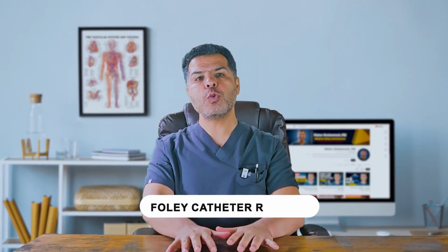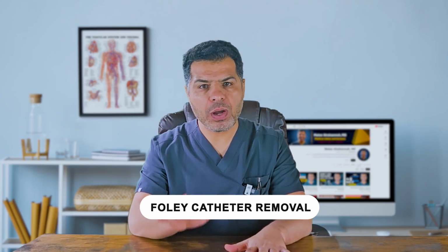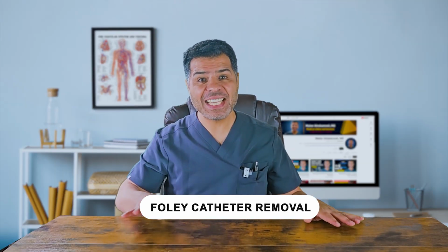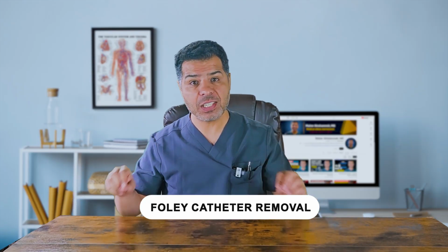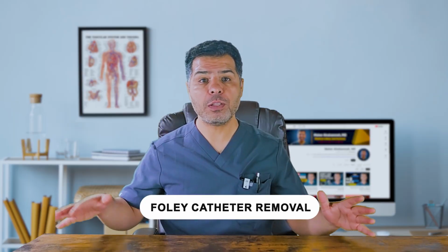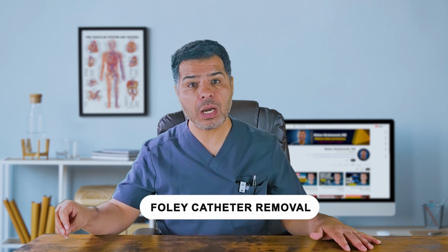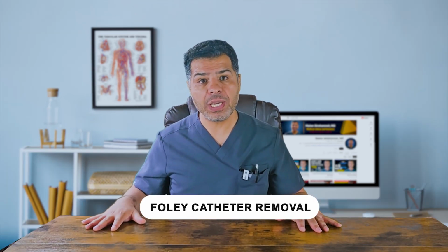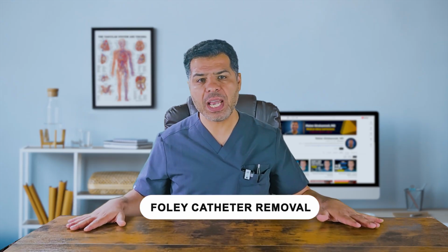And this brings me to Foley catheter removal. Removing a Foley catheter is straightforward, but there are things to know here. We should remove the Foley catheter as soon as the indication no longer exists. Do not wait any longer. I cannot stress this enough. Many patients have a Foley catheter for no clear reason. The patient is hemodynamically stable and no longer needs strict hourly urine monitoring, or we remove it when we want to give a voiding trial after treating urinary retention, or if the surgical indication has resolved.